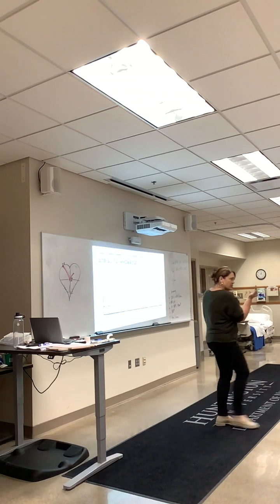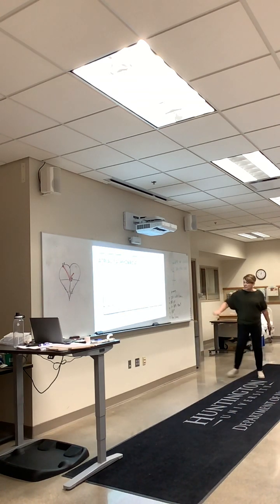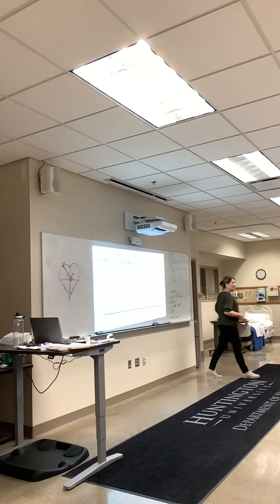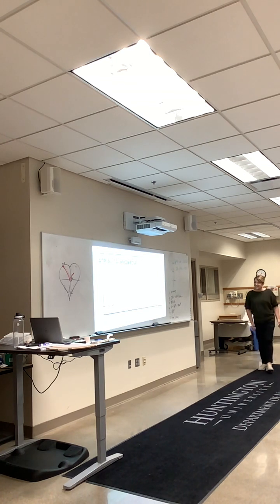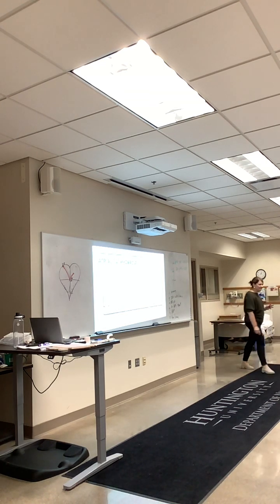It's just kind of starting to jump into my T wave there. Here's your rate general range, 150 to 250. As long as I still see a P wave, I know it's atrial. If I don't see a P wave, I call it something else, and I'll show you that in a few minutes. So, same thing, P wave for every QRS. It marches out nice and even. It's just faster than 150. Right? Ready for me to go on?